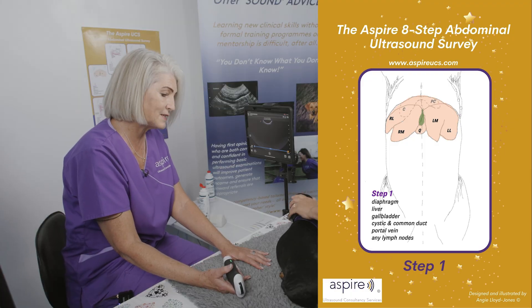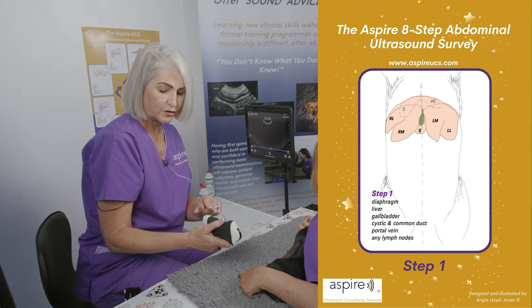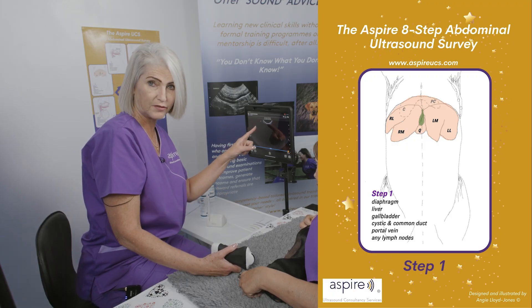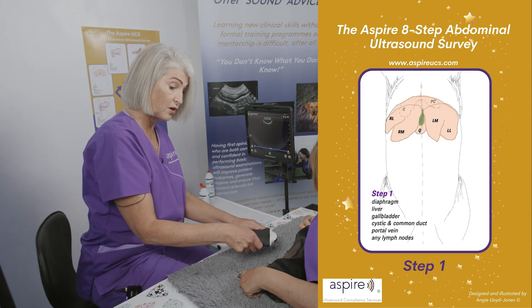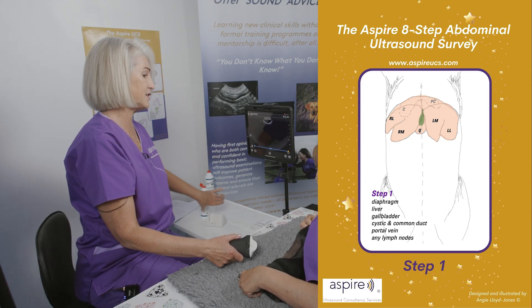We're going to make sure that the orientation marker is towards the patient's head, and this light on the Clarius corresponds to the left-hand side of the screen. It's really important you get your orientation marker correct. So if we're doing a long axis section of the liver, we want the orientation marker to be facing Lily's head, and that corresponds to that Clarius logo.